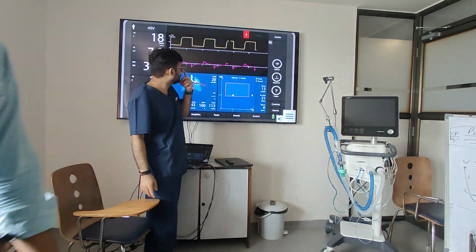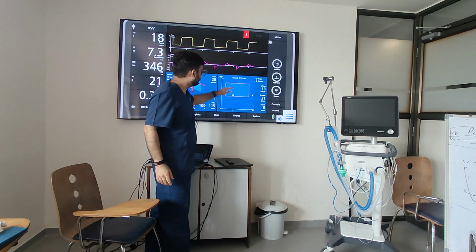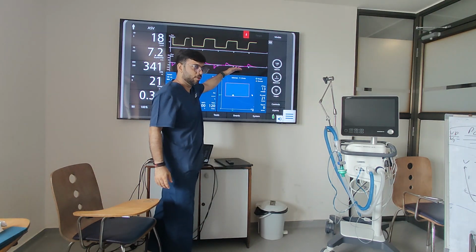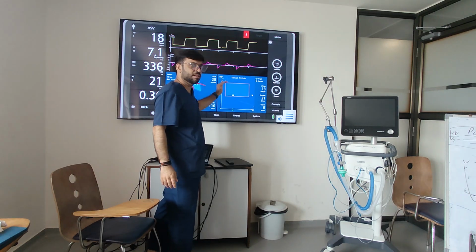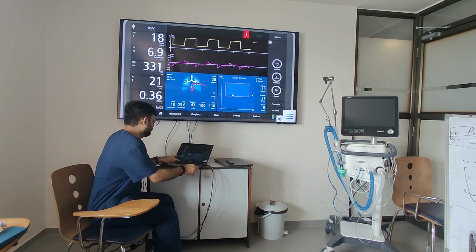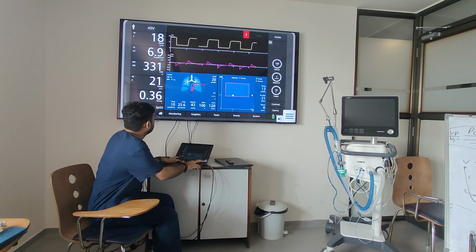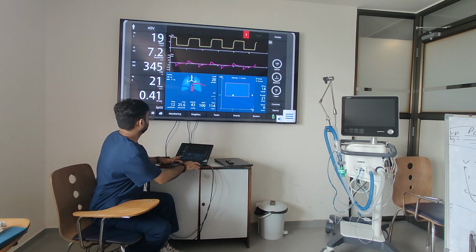Now, this part we already saw on the graph. Here we are safe with no trauma. Here we are safe, there is no auto-PEEP. There is no dead space and there is no apnea. I'll make a few more little changes to see, and now identify what's happening. It has intelligently changed the pressures. If you see, it has made 13, 14, 9, it has done all those things. It has increased the tidal volumes, the controls, the frequencies.